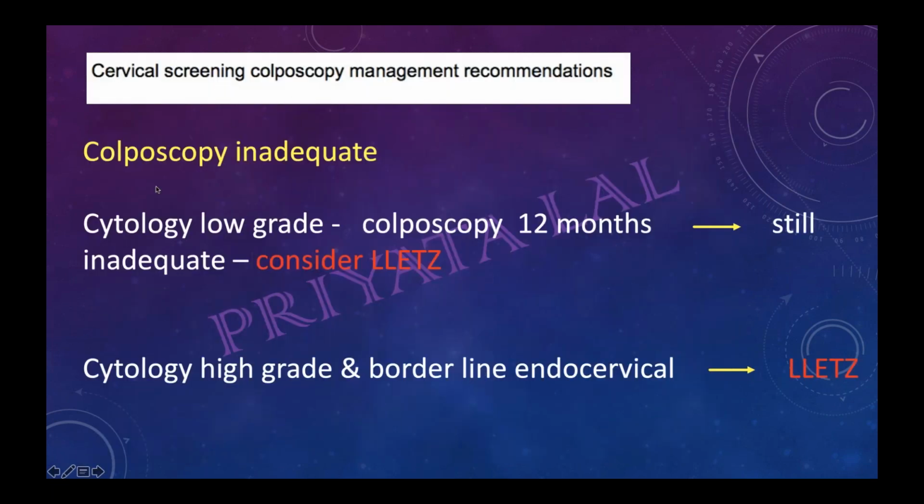So is the thing clear, people, with this slide? Yes, Dr. Priyata. So this is the thing. If I'm not happy with the colposcopy, I'm not able to see the TZ.